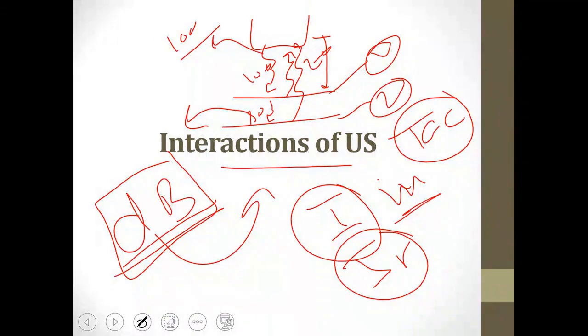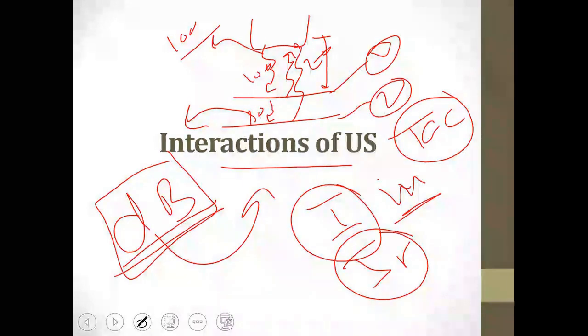If you change the TGC so the upper part receives amplification, will the image differ or not? No, it's done. He sent what he sent. This is the incident, and he doesn't play with it. When he receives it, since it comes at a different time, coming from a far depth, he knows according to this time that it comes from a distant depth and with a weak signal. So he calculates the decibel level and compensates it according to the value you have set. Right, doctor?